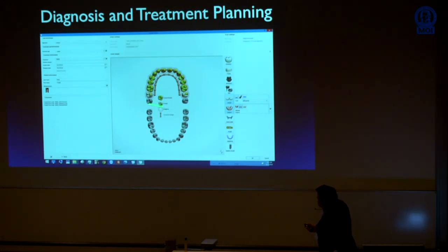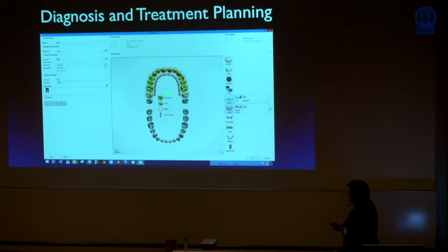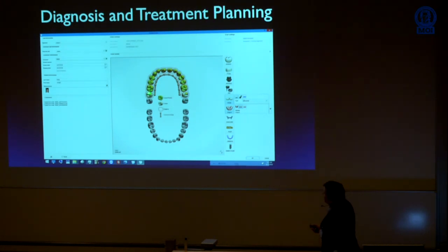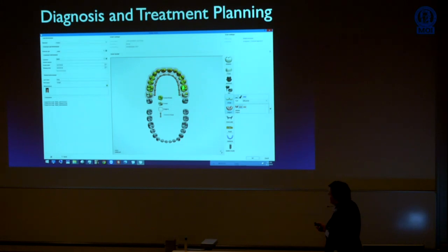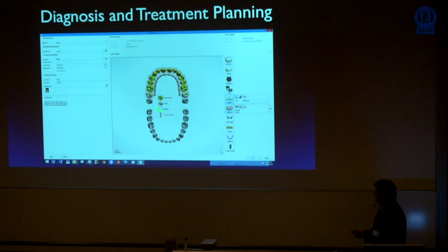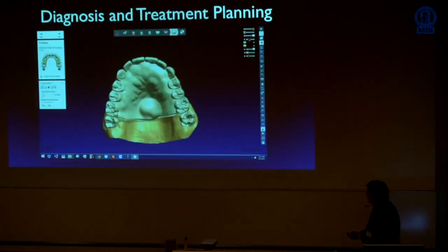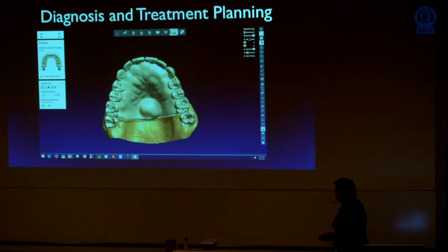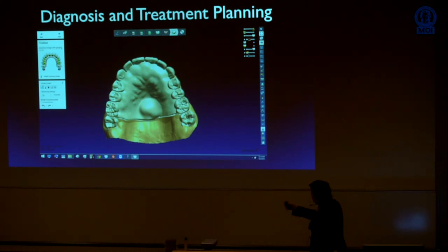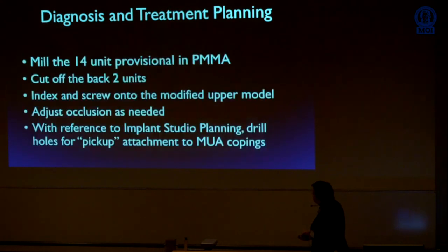So we modify the design. This may be tough to see, but there aren't any teeth in the second molar positions, but we pretend there are, and we call those just crowns. So we set it up as a conventional crown and bridge case, calling the second molars crowns and all of the rest of the teeth pontics, and that lets us unlock the feature for gingiva. Then we design a grossly exaggerated gingiva. This is just how it turns up in its default position. Then we design parts of it away.